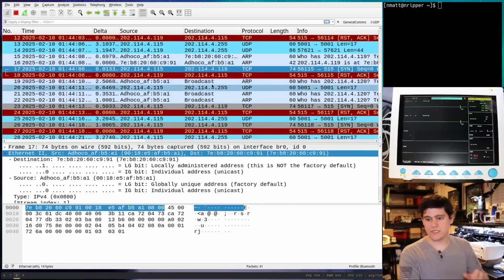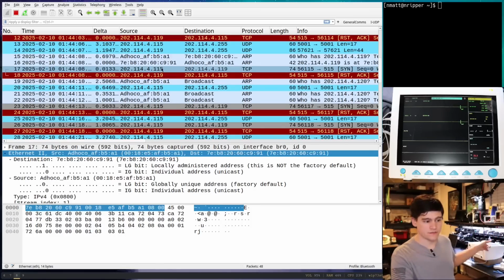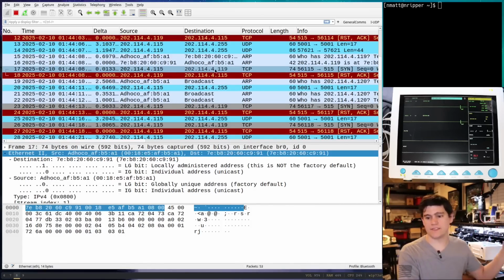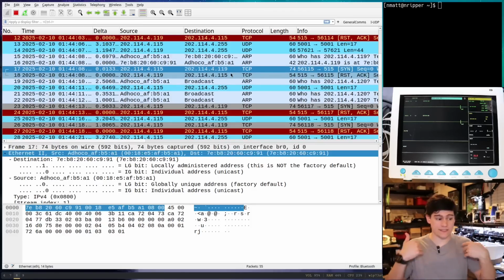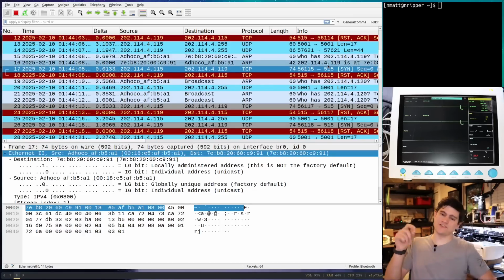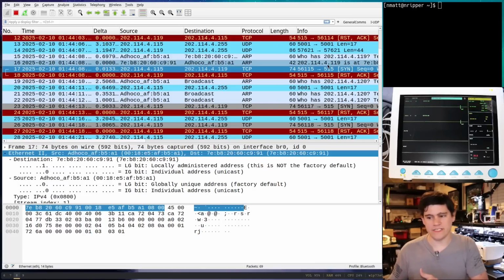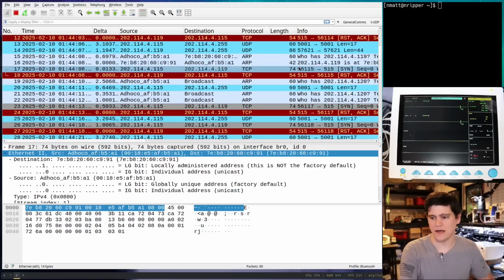So here we see a lot of connection attempts from that 115 address. That's the patient monitor. It's connecting to 119, so that's us, our Linux machine here, and it's trying to connect to port 515. Now what's interesting about that port, and this is a huge rabbit hole that led nowhere that I went down, is that it's commonly reserved as a printer port. It's an old school printer protocol, and they are not using that protocol at all, even though they're using that port.